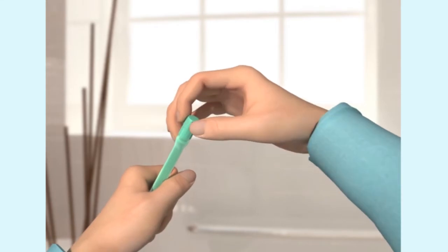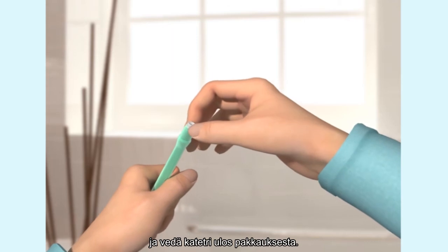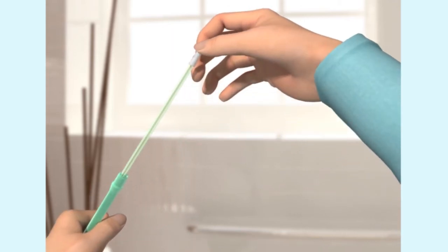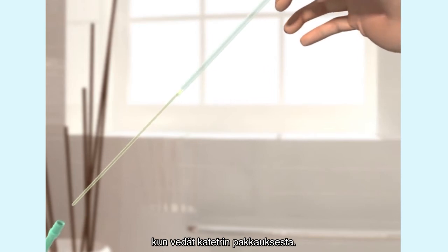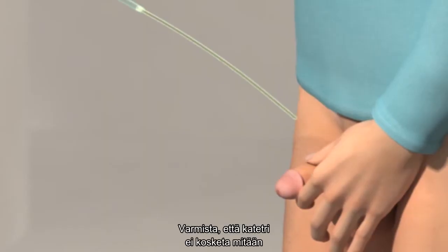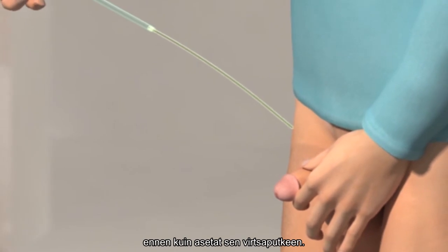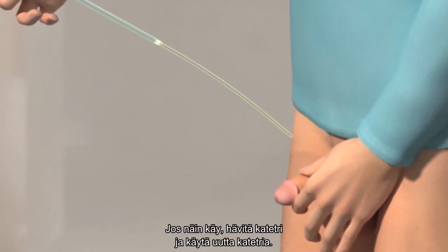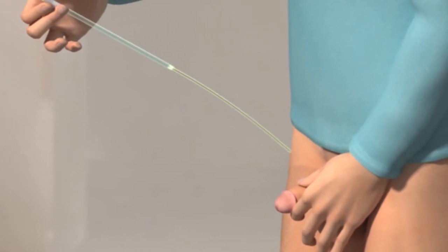Open the catheter, grab the white funnel connector and pull the catheter out of the tubing. You may feel a little resistance when pulling the catheter out of the tubing. The catheter is now ready to use. Make sure that the catheter does not touch anything before you insert it into the urethra. If it does, discard the catheter and use a new catheter.